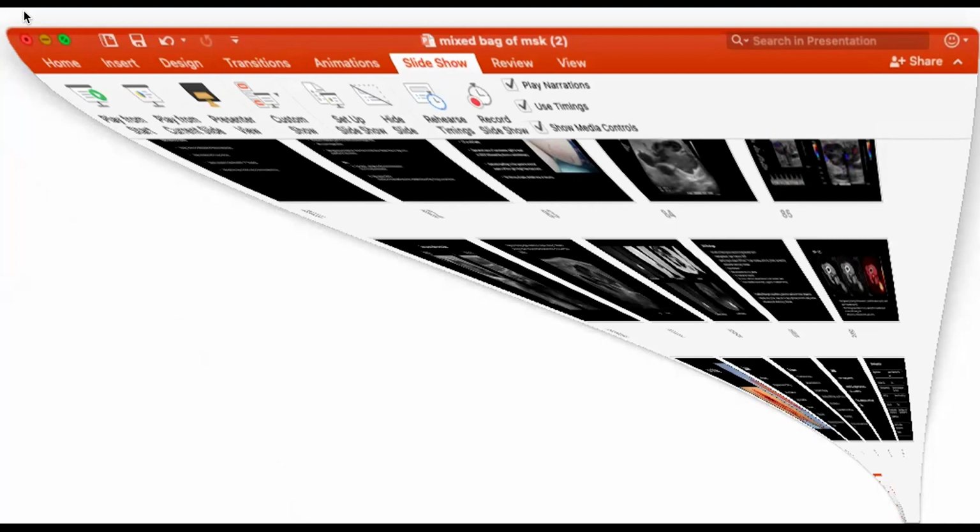Ankit, Rajesh? Another reason why this posterolateral corner injury matters is that it is often associated with a tibial plateau fracture, posterolateral rim, and those chondral injuries and fractures, ultrasound is not a great modality for. And these fractures are not that well seen on MR as well. So that's why I think MR is absolutely essential in these kinds of cases, where you suspect a popliteus tendon injury.